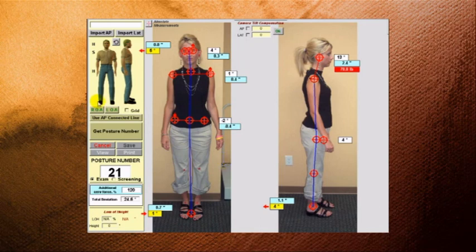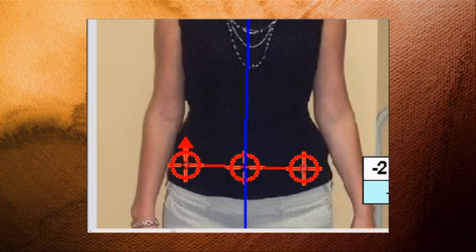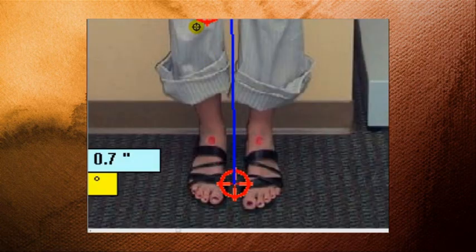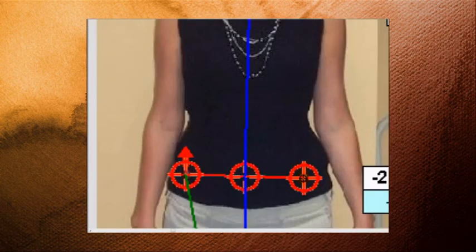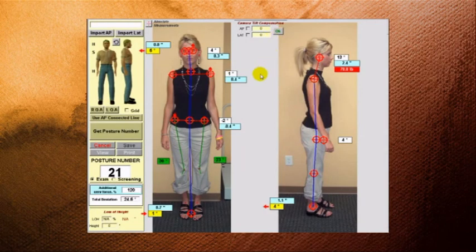And if you want to do a Q angle exam, again we've automated the use of the Q angle so that it jumps down and automatically goes to the points to measure. And again, it leaves the crosshairs on the screen.